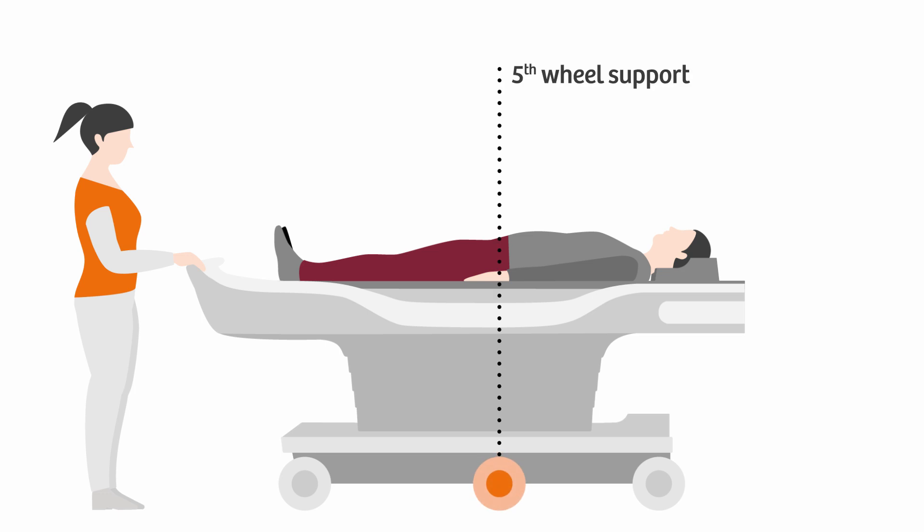A fifth wheel comes down that improves the table's maneuverability around every corner, regardless of the user or patient.